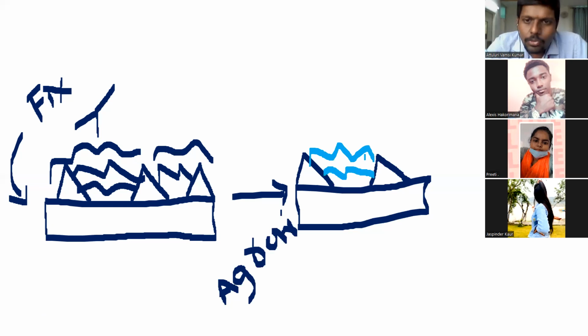There are a few traditional approaches to removing these protein cross-links. The first technique is by using some enzymes.